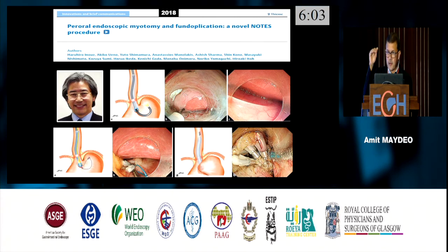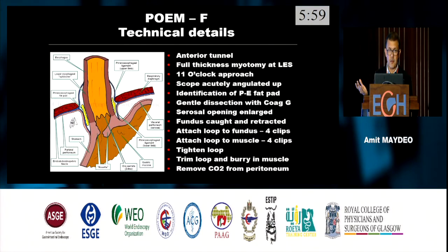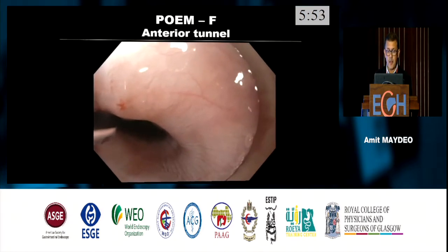So we have to do an anterior tunnel, and in all patients, you will have to do a fundoplication. You cannot predict beforehand who will develop GERD or not. So therefore, this is a very new procedure. I will quickly show you.